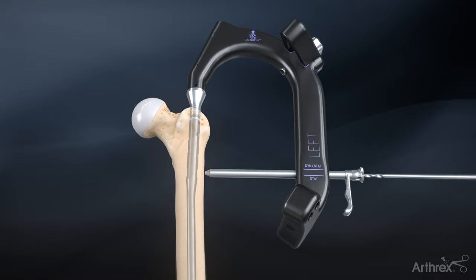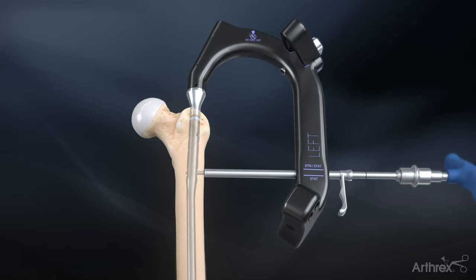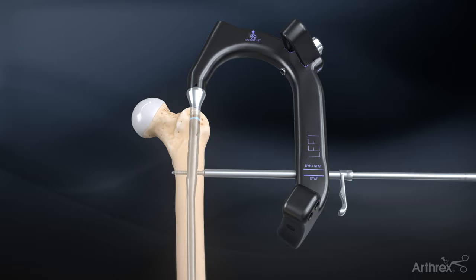Remove the drill guide sleeve and insert the 5 mm cortical screw assembled on the captured hex driver until the black laser line is flush with the end of the sheath.